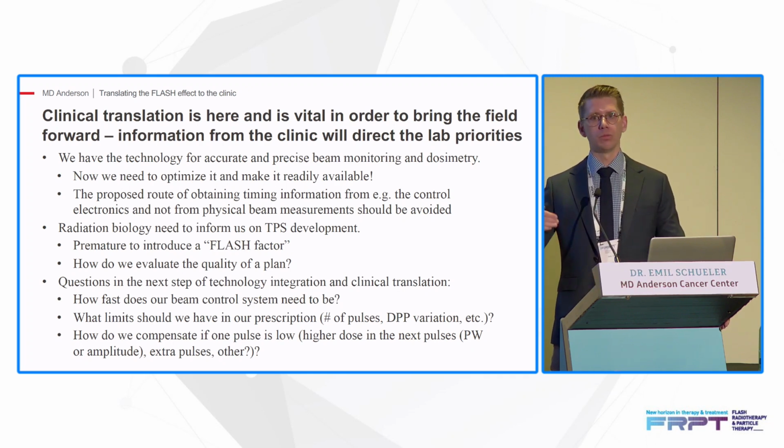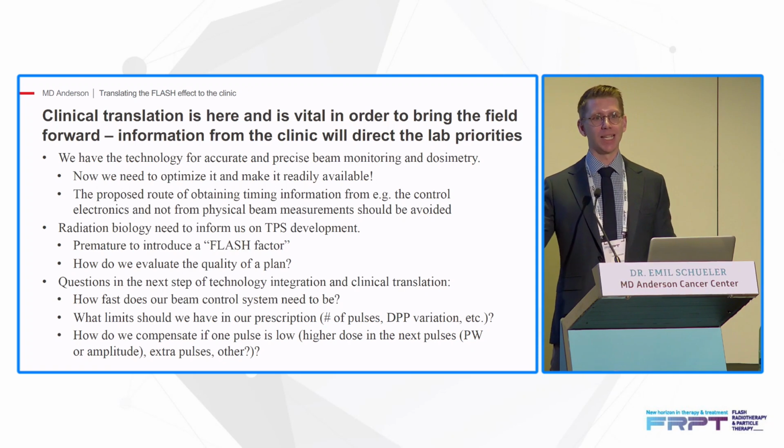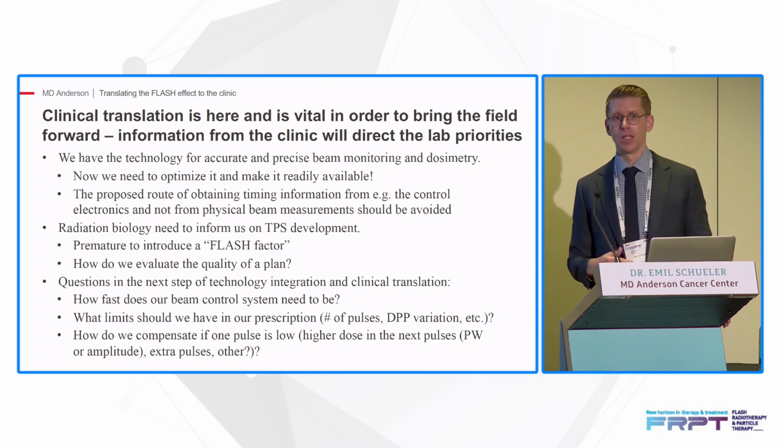And just to summarize a little bit what I've been talking about, we have the technology for accurate and precise beam monitoring. We just need to get that out there and fully implemented. Radiation biology needs to inform us of TPS, or treatment planning system, development.